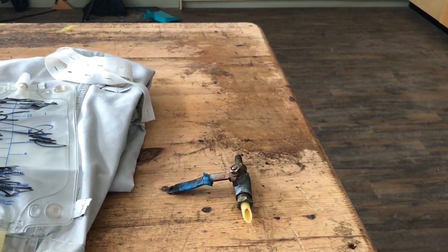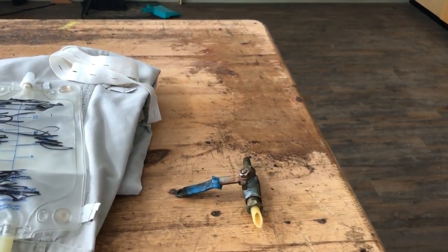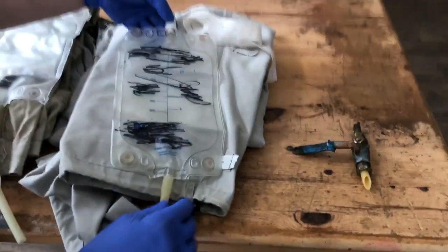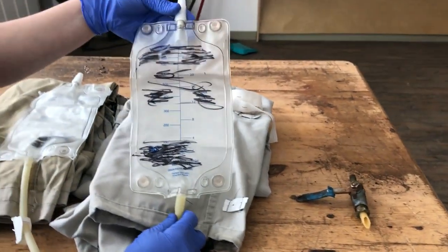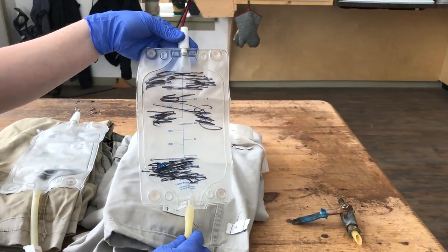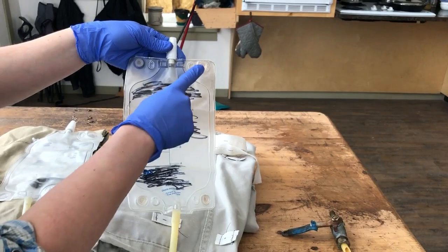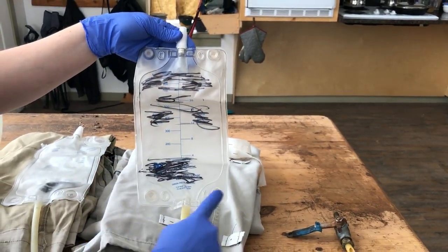Now, in conjunction with the plumbing valve, I don't attach my leg bags to my leg. I attach it to my pant legs. And the way I do that is I use leg bags with 4 buttonholes on them, 2 at the top and 2 at the bottom.